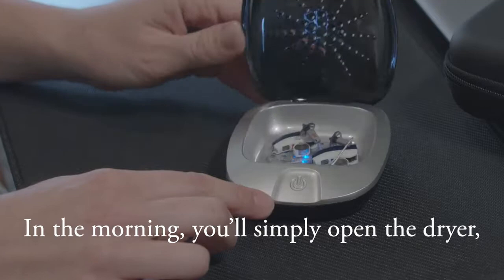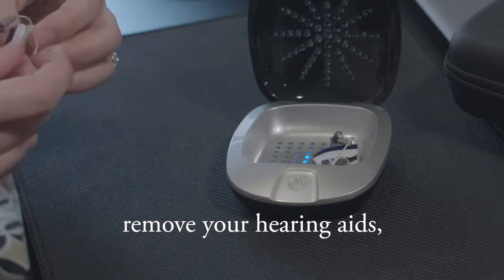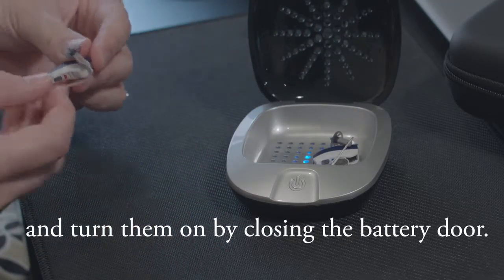In the morning, you'll simply open the dryer, remove your hearing aids, and turn them on by closing the battery door.